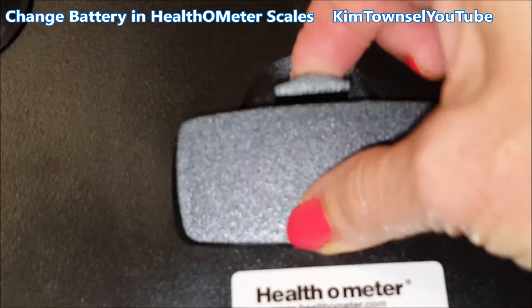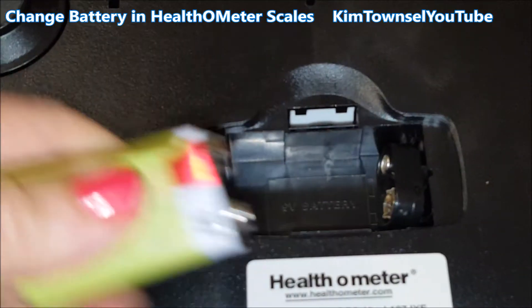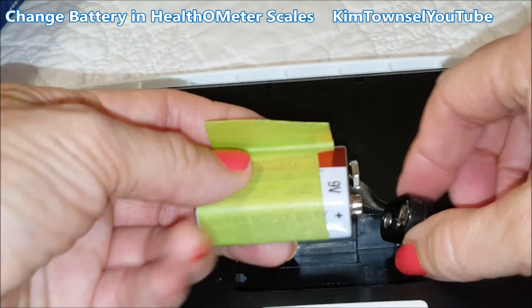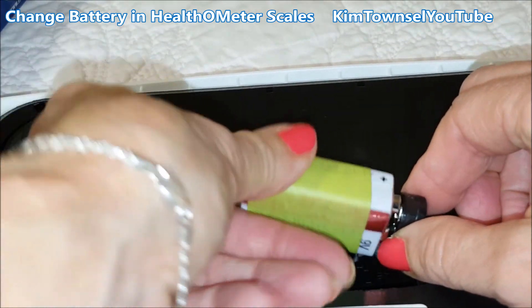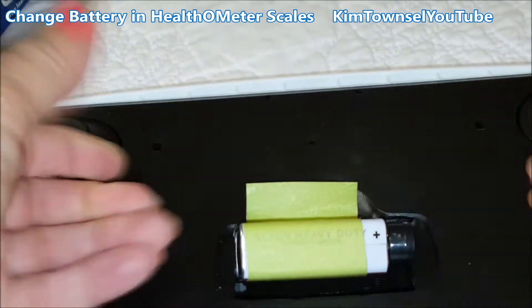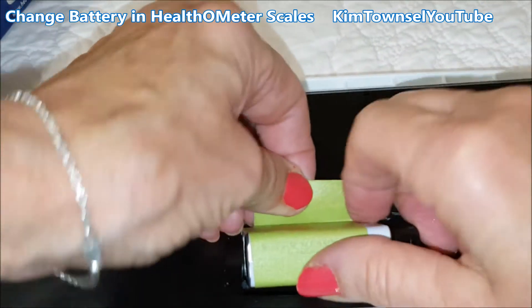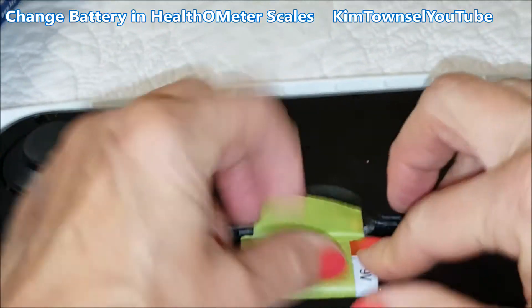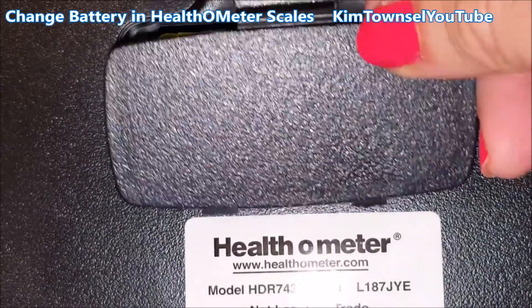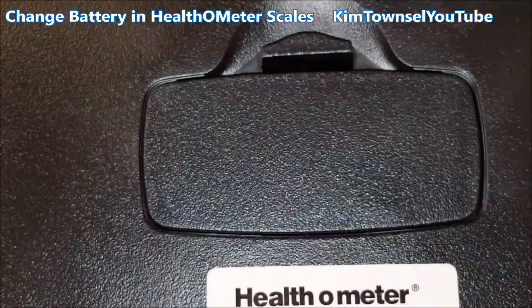One more time — it opens like this and I pull mine out like that. Get the connectors so that they're opposite. Pop it in — that one's hard to go in because I'm using my non-dominant hand. And then these little lips go under like that, and it clicks in.